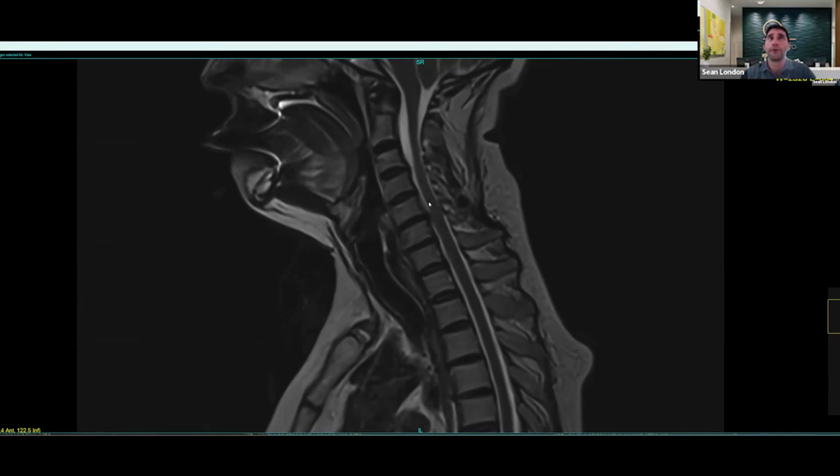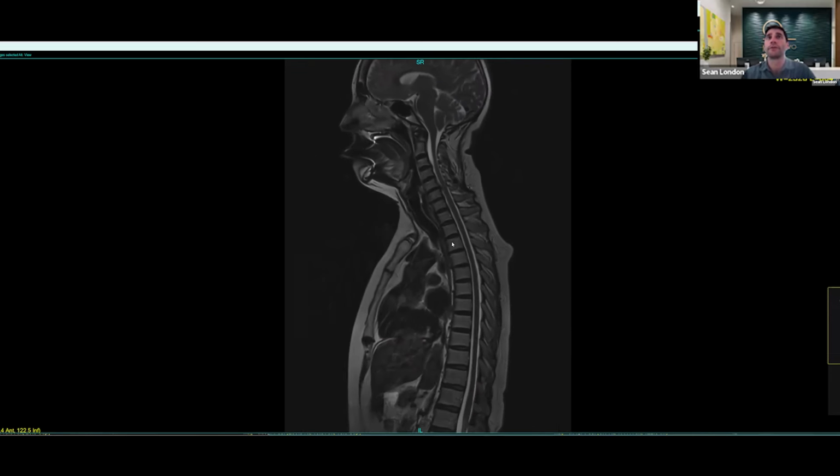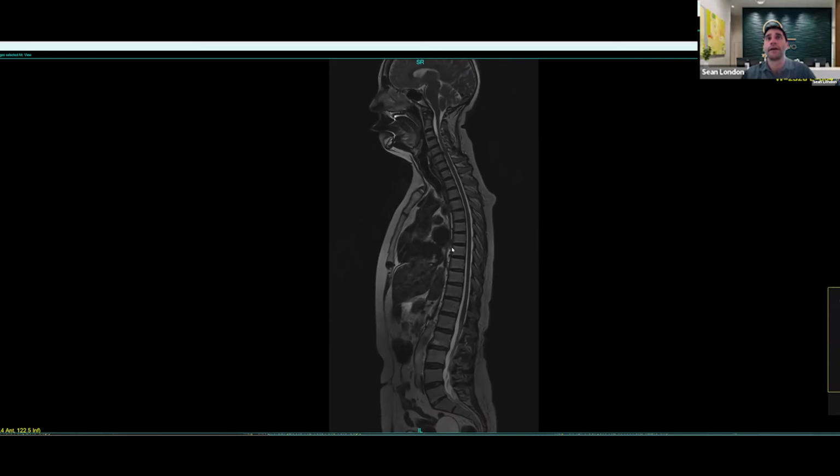But this is a good thing to know about so that we could do any lifestyle modifications to prevent further degenerative change. And generally too, it's really important to correlate any of these findings with any actual symptoms. It's so common for us to have wear and tear and not have any symptoms. In that case, there's really nothing actionable other than just trying to modify our lifestyles to prevent further degeneration. Overall, this is a very typical good-looking spine, actually for 59 years old.